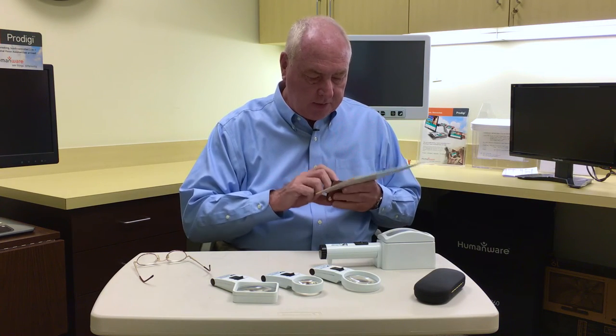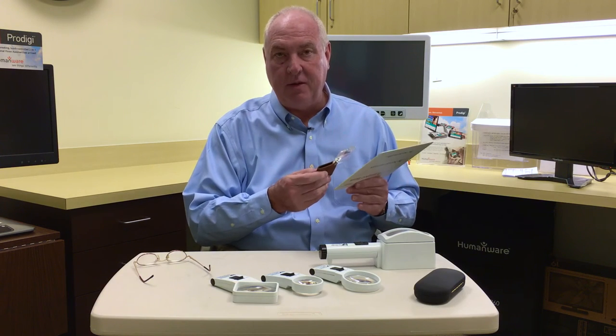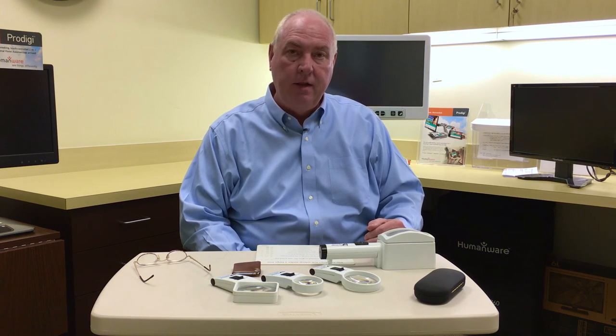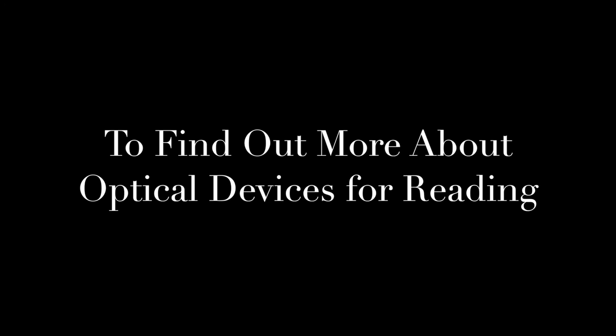There are other small optical devices. One that's really popular is a small pocket magnifier that pulls out and is good for spotting — not really for extended reading, but spotting a price tag in the store or a bit of a menu in a restaurant can be very helpful. So those are some of the devices and we're glad that you could join us today. Please see some of our other videos on how to read with video and other magnification devices. This is Tom Persky — thank you. To find out more about optical devices for reading, call us at 312-997-3686.